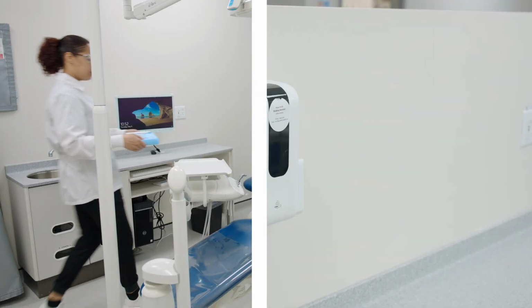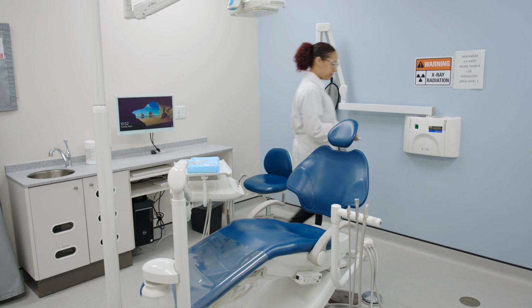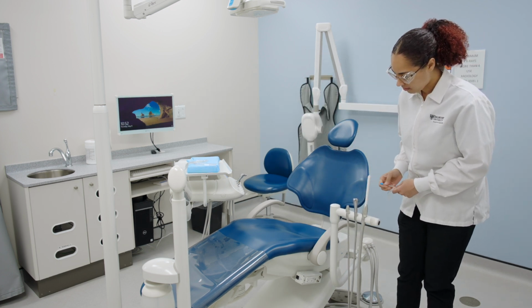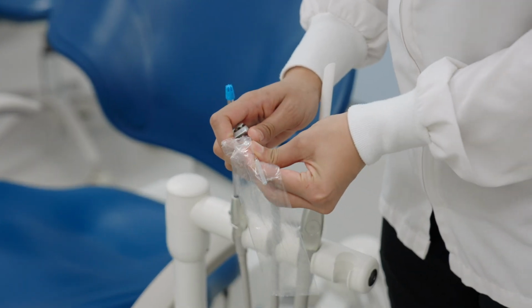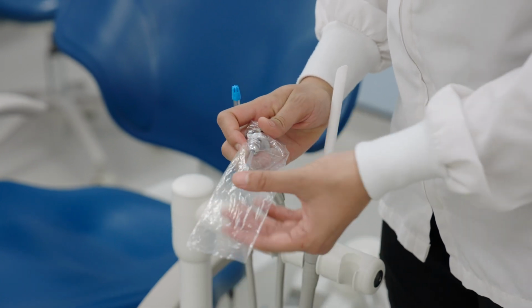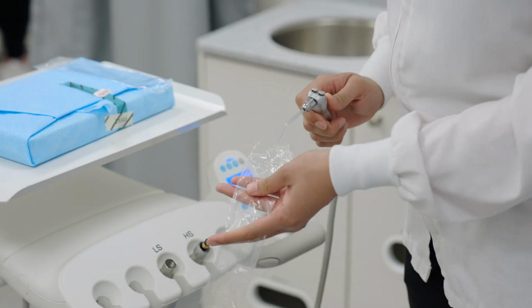Now barriers will be placed on the dental unit. Using clean, ungloved hands, place the high and low volume suction tips and 2 air water syringe tips on the unit. Once all the tips have been securely placed, place a plastic sheath over the air water syringe, poking the tip through the end of the bag. The final barrier to be applied is the operator handle barrier.